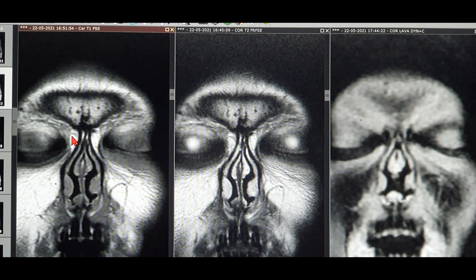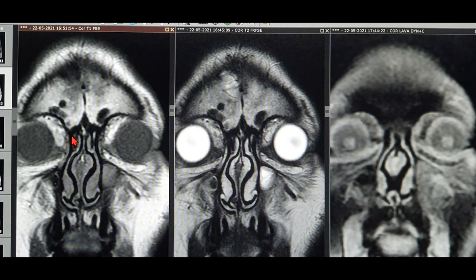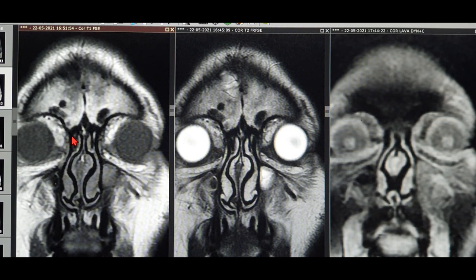I did the routine nasal endoscopy, but it did not show any positive findings for mucormycosis. The nasal mucosa was healthy — no eschar, no crusting, no pus whatsoever. It's quite possible in many patients that nasal symptoms and signs may not appear initially, and the nasal endoscopy can be completely normal even though the sinus is showing fungal changes.